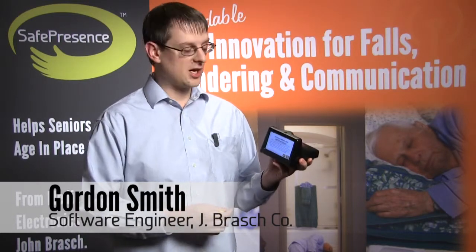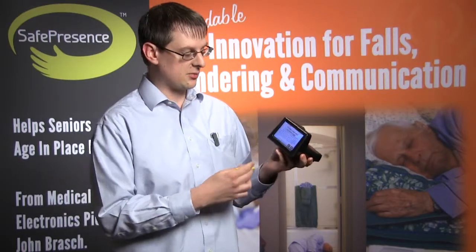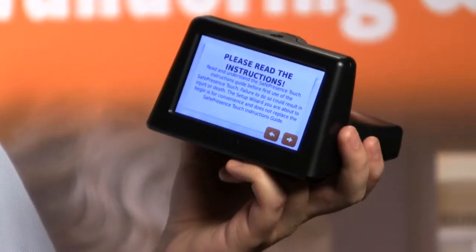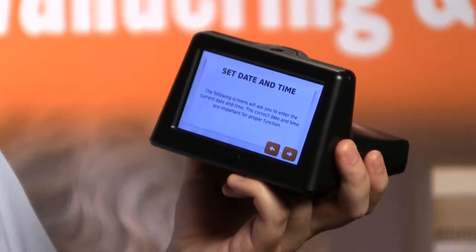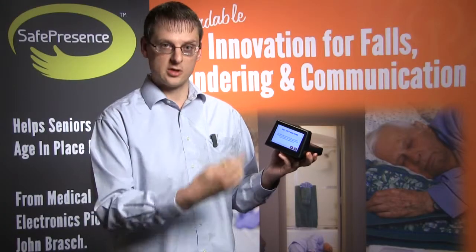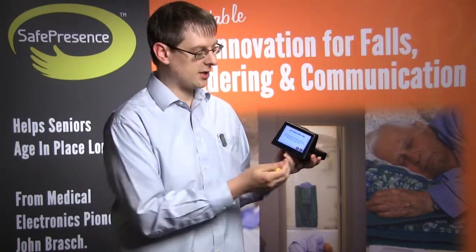for the SPTouch. Now, the first screen you're going to see is the please read the instructions. Now, we highly recommend you read the instruction guide that comes along with this device. After you have, you can press your next button here and it will ask you to set up your date and time. This is for normal operation of the device, so it knows what day we're on and what time it is for your bedtimes later.